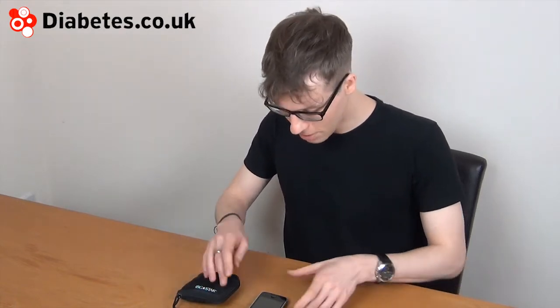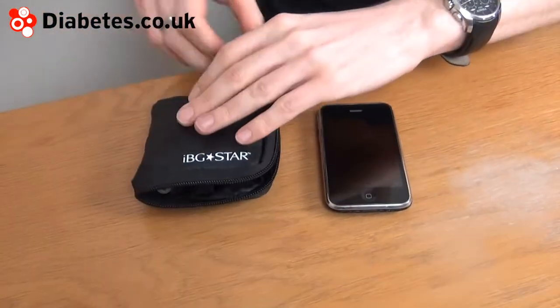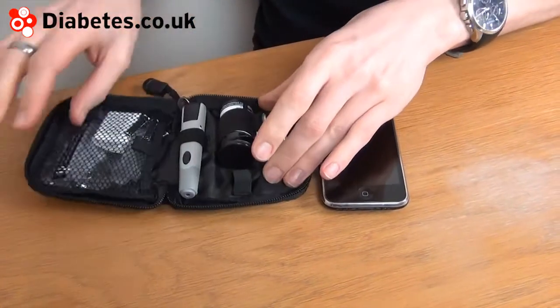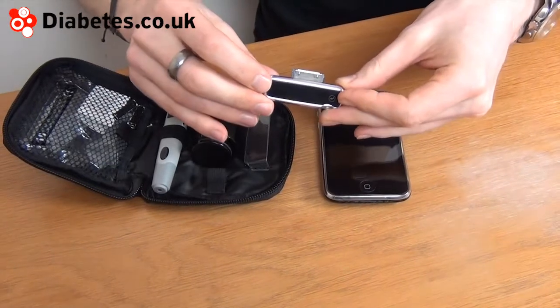I'm going to present the IBG Star from Sanofi Aventis. The glucose meter is somewhat unique because it plugs directly into an iPhone or iPod touch. The IBG Star is one of the smallest blood glucose meters available — as you can see, it's a tiny meter.